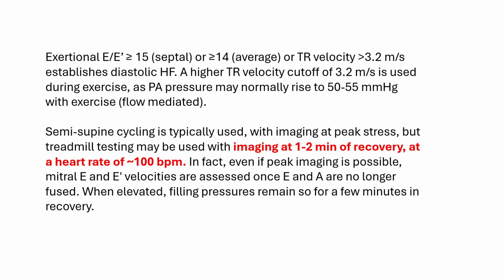Even if imaging is possible at peak exercise, mitral E and E prime velocities are assessed once E and A are no longer fused. And keep in mind that when elevated with exercise, filling pressures will remain so for several minutes in recovery.